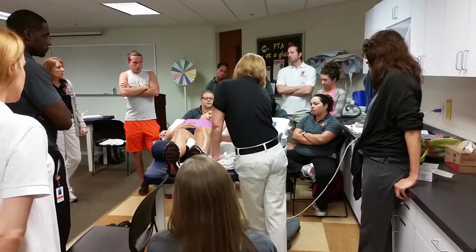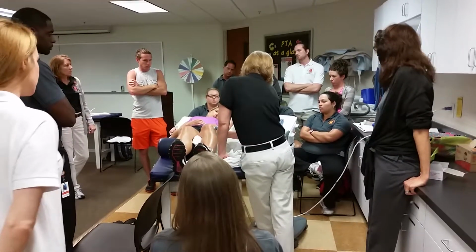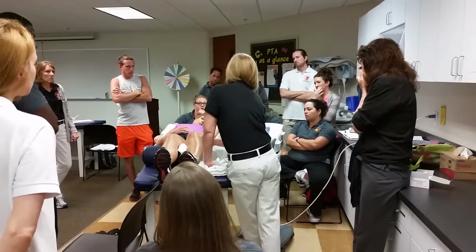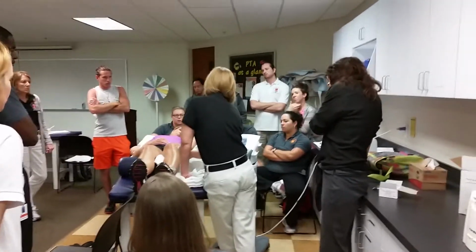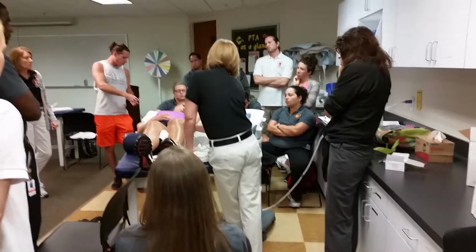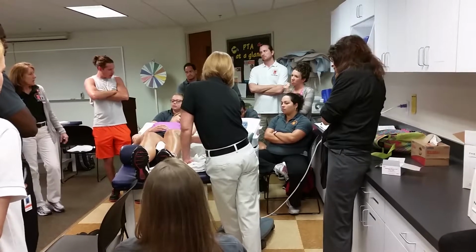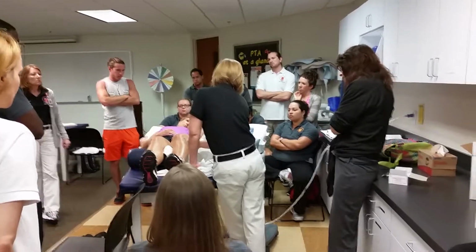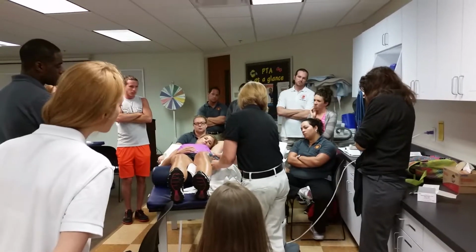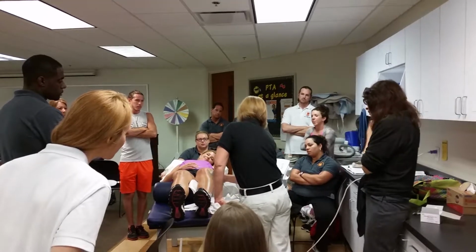I know you don't want to just hold it in one spot, but do you kind of stay in one spot until you figure out if it's getting heated up in that area, or do you go across that whole area? You keep moving it. You keep moving the sound head. You don't stay over one spot because then you're not moving it. And you can't lift it off. No, you cannot lift it off. Now Dr. Z would probably, that's hard for me to do. They go like that. To me, it's not worth it.